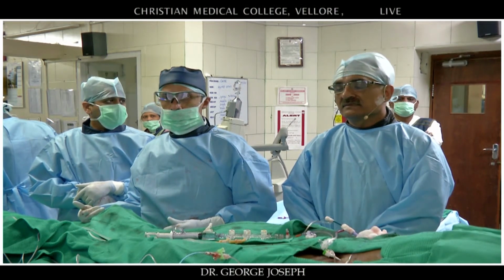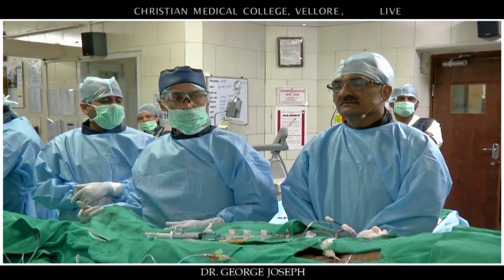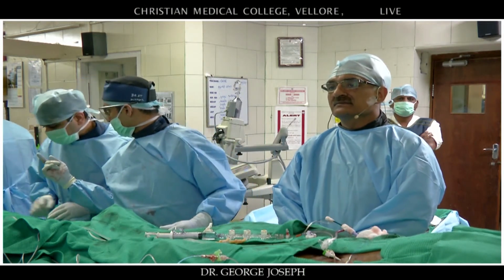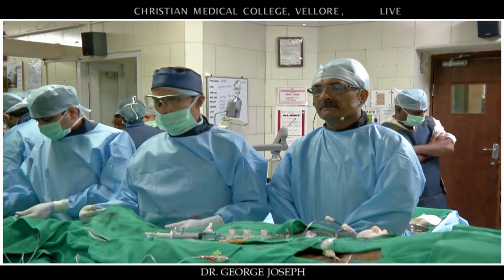No, it's an excellent demonstration. It's a very thoughtful procedure, a lot of planning, and you really helped demonstrate that very well. It's not something you can just go ahead and do. You have to think and plan for patient-specific anatomy because you're trying to use existing devices that aren't designed for this application. So very nice example, very nice demonstration.